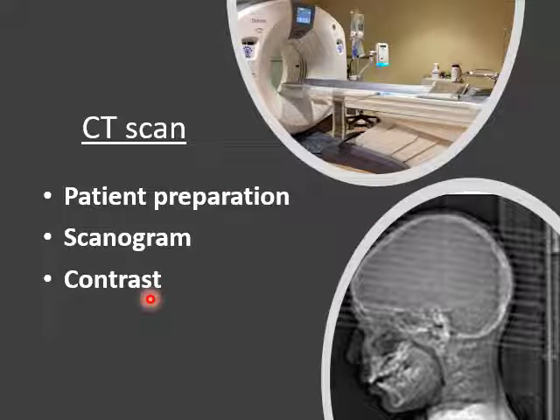The third item is the contrast media. The contrast media is not a routine for an ordinary CT scan. In the ER, patients are suspected with cerebrovascular disease, stroke, or trauma, so there is no need for contrast.